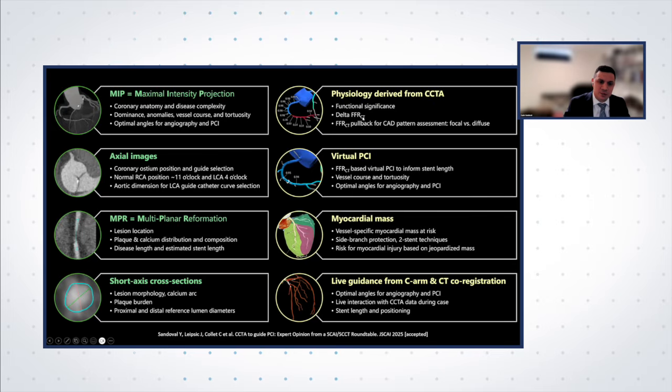And this unlocks now the opportunity to also go beyond what we call FFRCT 1.0 to FFRCT 2.0, in which now you're using this beyond diagnostic purpose, but you're using this to phenotype coronary artery disease, understand whether the lesion is focal or diffuse, but critically, get the component of virtual PCI, in which now you can understand what is the stent length that will provide an ideal improvement in flow in that vessel.